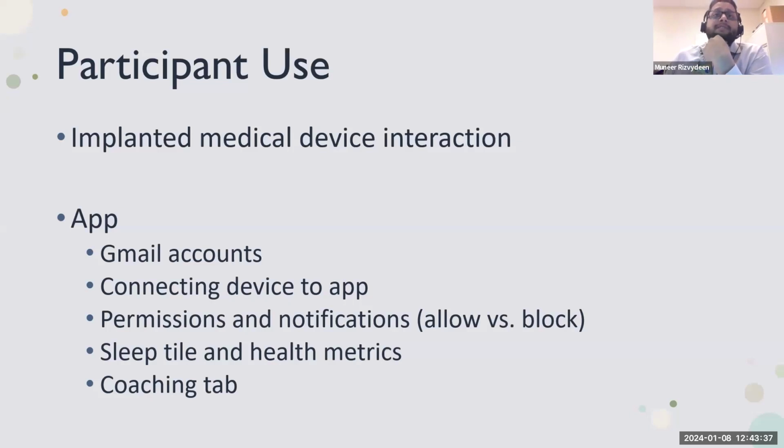We do let participants know that the Fitbit is water resistant, but should not be exposed to water for extended periods of time. And we advise them to remove the Fitbit when showering, taking a bath, swimming, etc., and not to charge it if it's wet. But because they are taking the device off when they shower or take a bath, it's very important that they remember to put it back on, and we emphasize that to them.